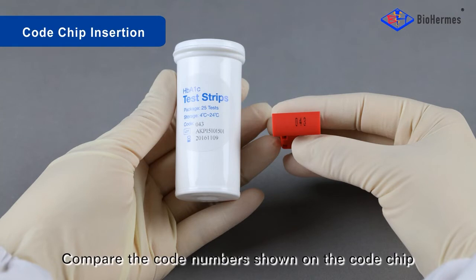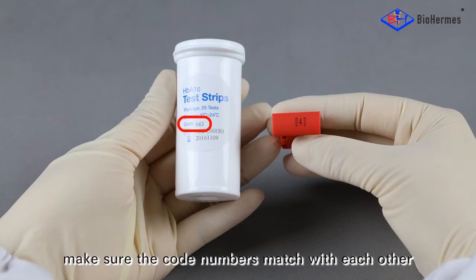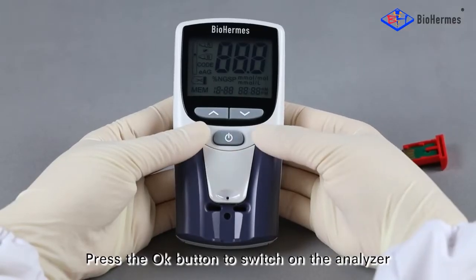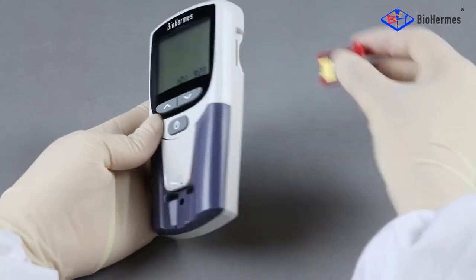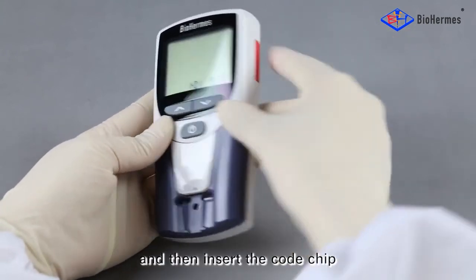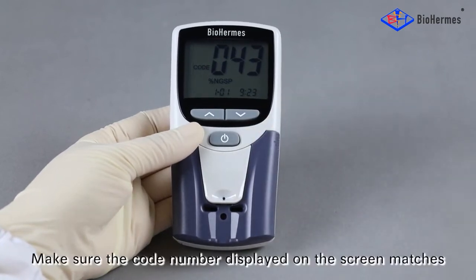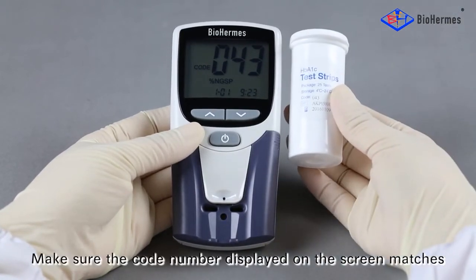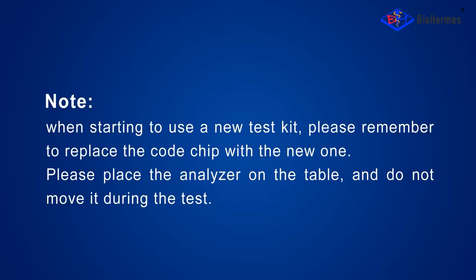Compare the code numbers shown on the code chip and the test strip file. Make sure the code numbers match with each other. Press the OK button to switch on the analyzer, and then insert the code chip. Make sure the code number displayed on the screen matches that on the strip file. Note: when starting to use a new test kit, please remember to replace the code chip with the new one.